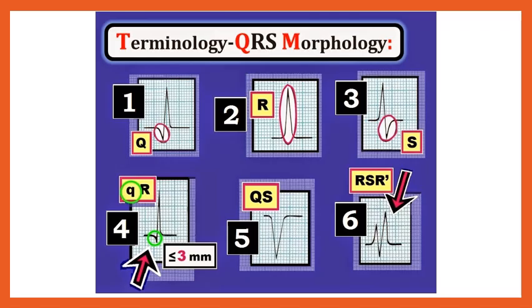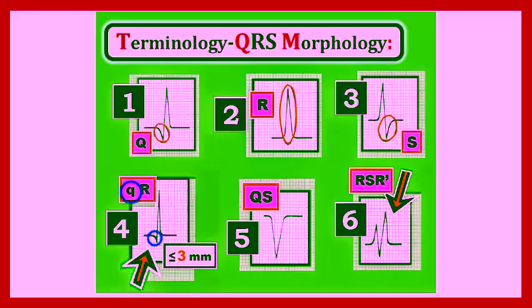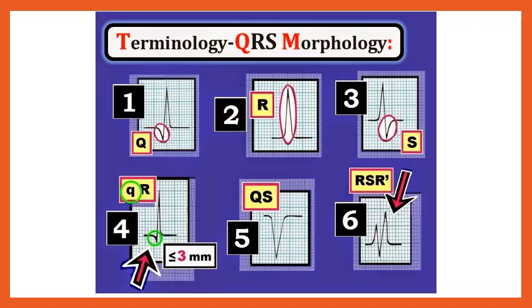The QRS nomenclature is actually the proper term. We need to be able to take a look at what makes a Q, what makes an R, what makes an S, because all of that is going to matter in several different things having to do with the 12-lead EKG, but certainly when we are identifying and differentiating right from left bundle branch block.